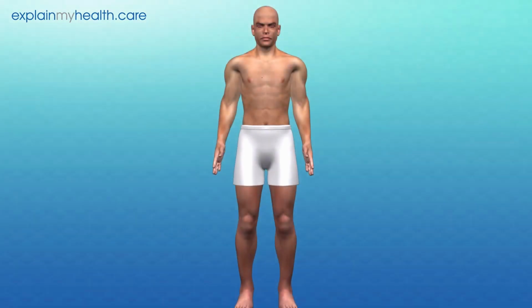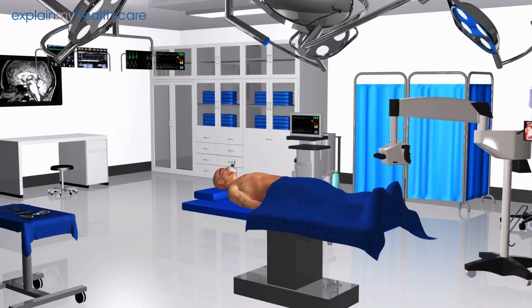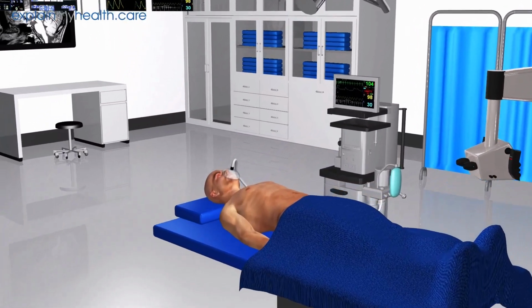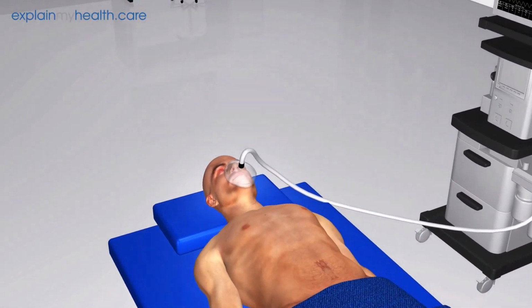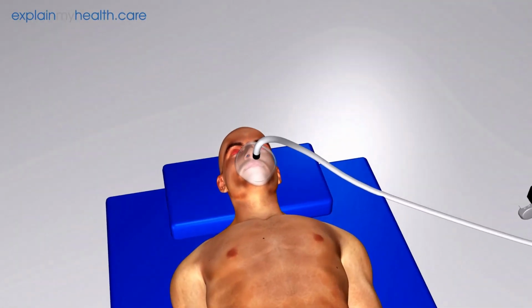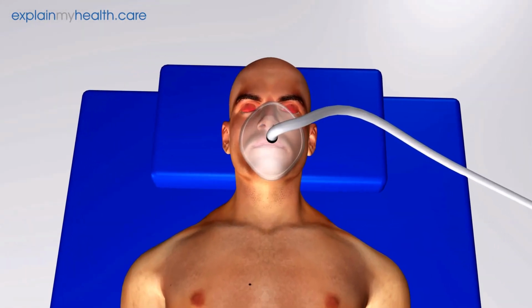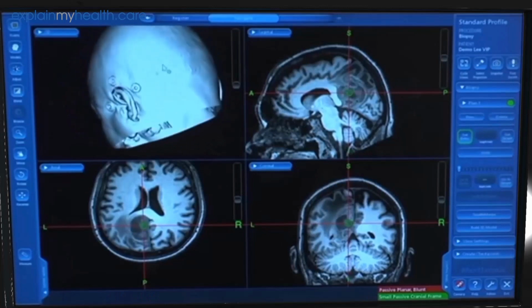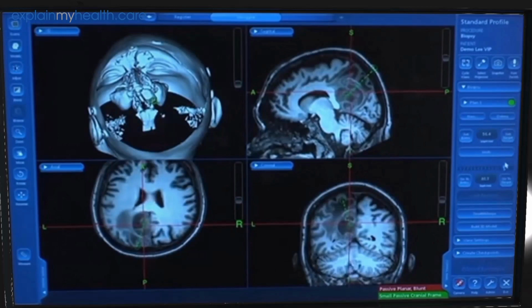The patient is usually positioned on their back, side, or front, depending on the location of the infection within the brain. A metal head clamp may be used to hold the head safely. Some of the hair may need to be cut or shaved to prevent infection getting into the wound. Where this will be and how much hair is removed will, again, vary depending on personal requirements. Sometimes 3D computing technology, like satellite navigation for the brain, is used to help the surgeon during the operation.